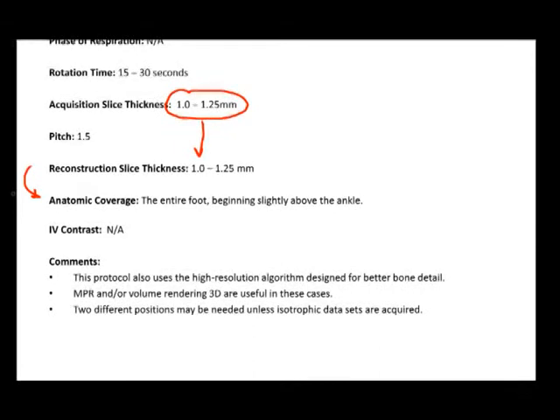MPR and or volume rendering are both useful in these cases, but be very cautious in volume rendering simply because if the patient is in advanced age, then you might not get as accurate imaging. MPRs are usually the better choice in this instance.